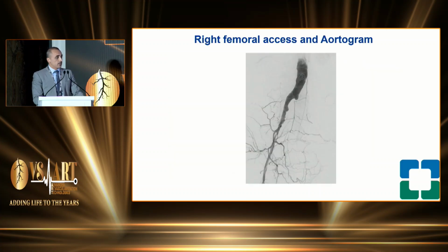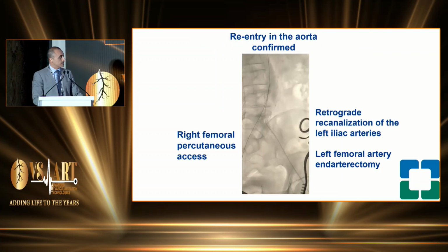So again, we elected to perform hybrid revascularization. We did the left common femoral artery endarterectomy, with percutaneous access from the other side. I tried to cross in antegrade fashion, couldn't, so went with the retrograde fashion through my endarterectomy and was able to get back into the aorta as you see here.